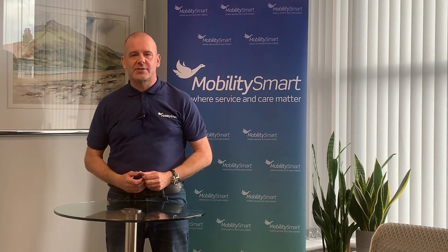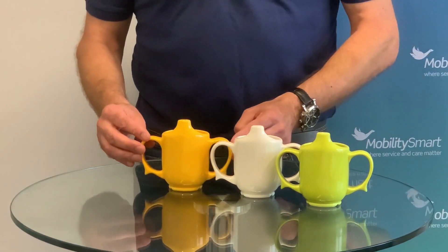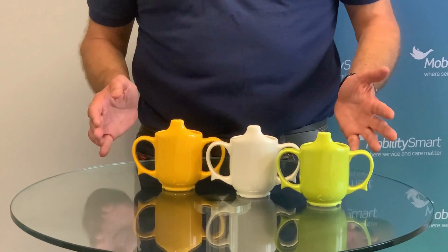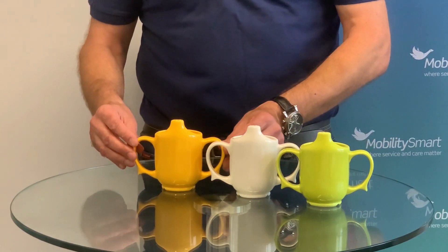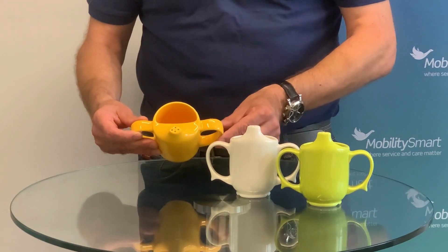Hello and welcome to this product demonstration from MobilitySmart. Our Wade Dignity two-handle drinking cups are attractive and versatile cups for anyone with limited grip strength who needs a cup that reduces spills and splashes, and those who need to have a controlled flow of liquid through the spout.